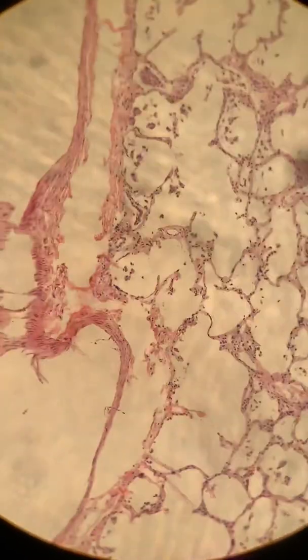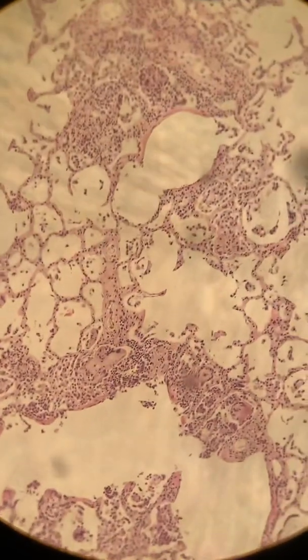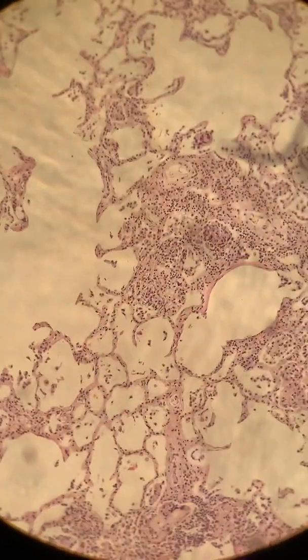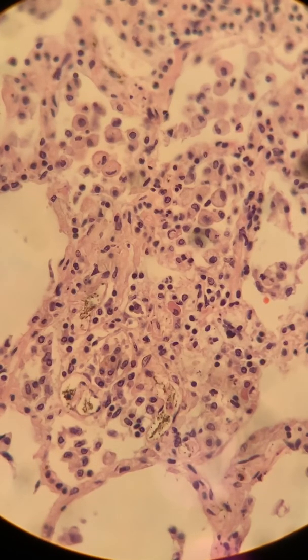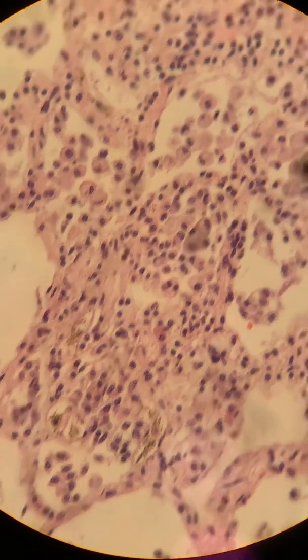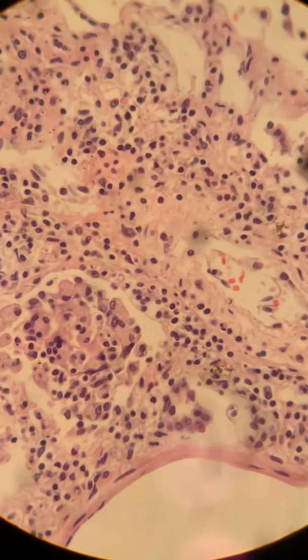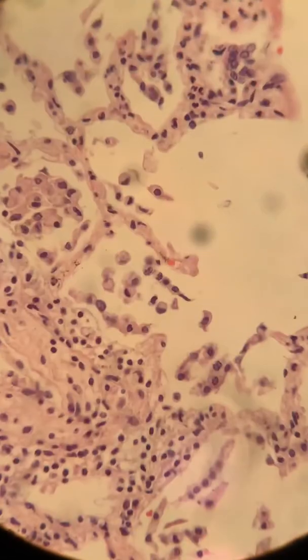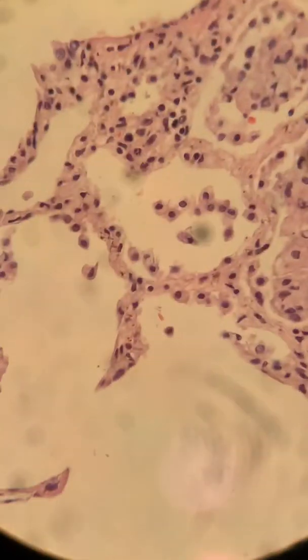And again, we will go down just to show you a closer up view of some of this inflammatory process. Here's a good area right here to look at. So we're going to go down even closer as I bring it into focus. There are some foamy histiocytes in this infiltrate as well. And as I continue to scan around, we're going to see more of the acute response.